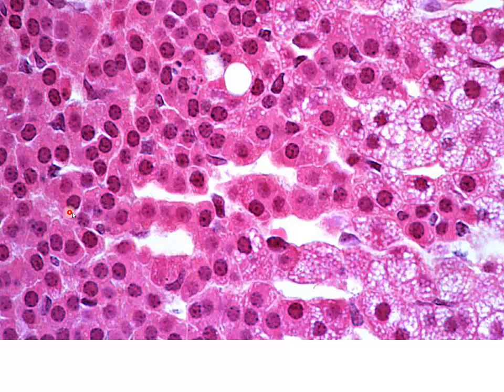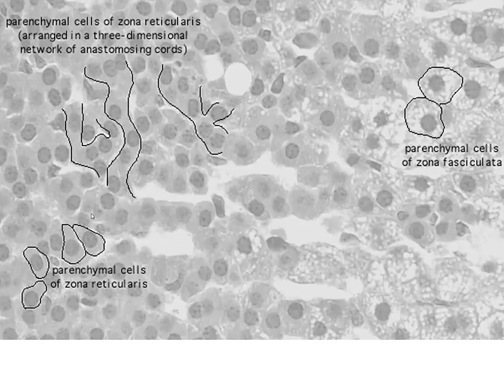But again, these are going to remain in somewhat this columnar chorded appearance. We'll see this a little better as we step back and look at a higher magnification of this. But as we move from the fasciculata, we're moving into the zona reticularis, or the network of cells that we see here. This is going to be our third and deepest cortical layer adjacent to the medulla.